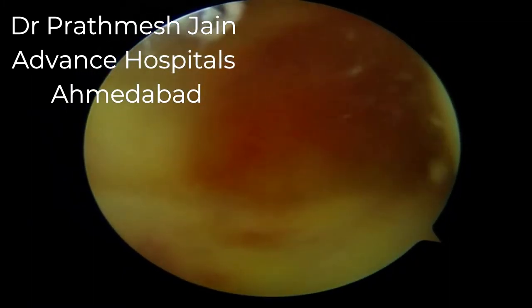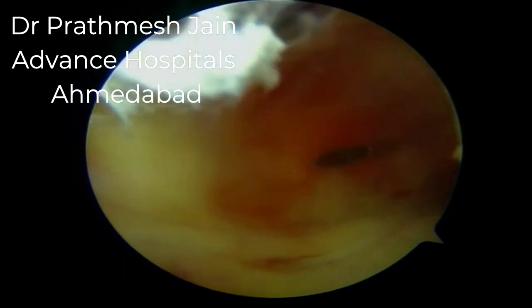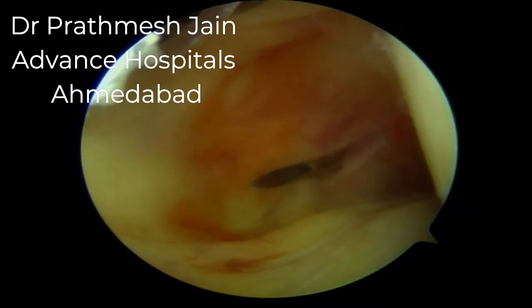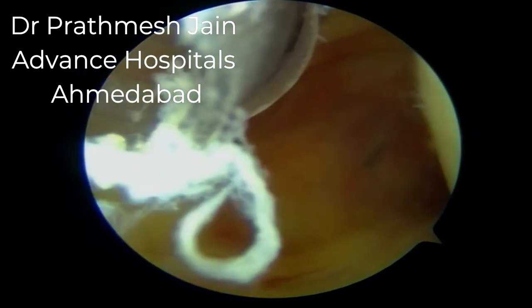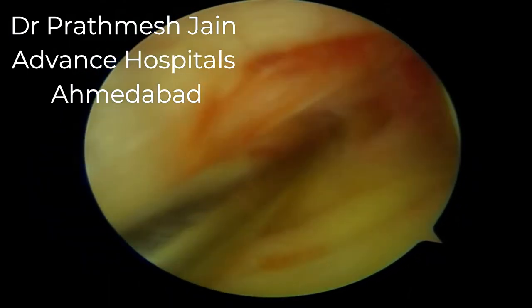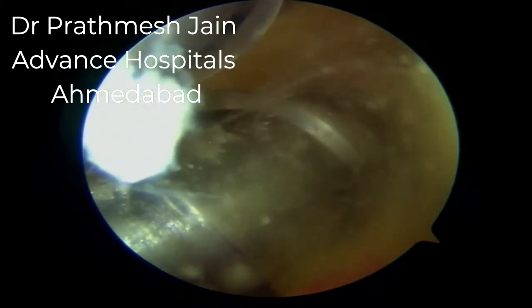This approach provides a very nice view of all important structures and a safe approach to the posterior dangerous area of the knee. We use a spinal needle to direct our low posterior medial portal, made by the same technique using a switching stick, over which we insert a seven-millimeter plastic cannula. This completes our portal placement on the posterior medial compartment.